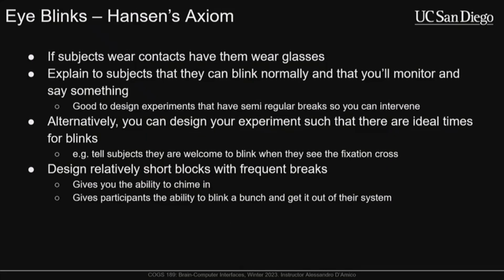Okay, any questions about blinks? It's a very common one. Okay, cool.